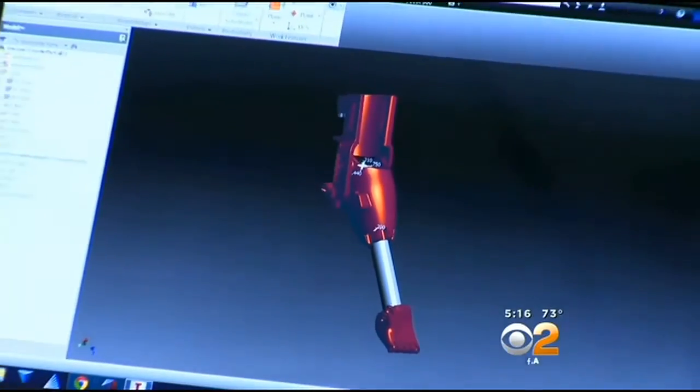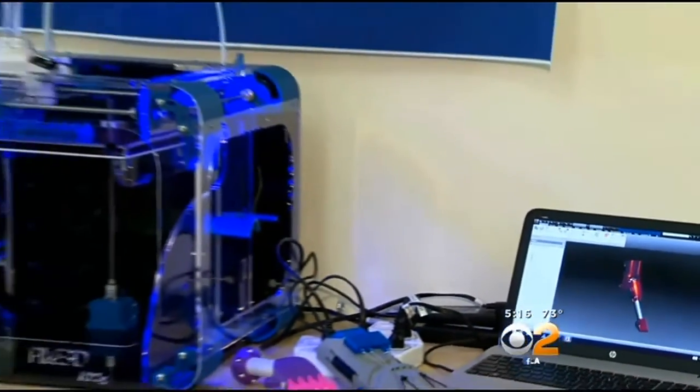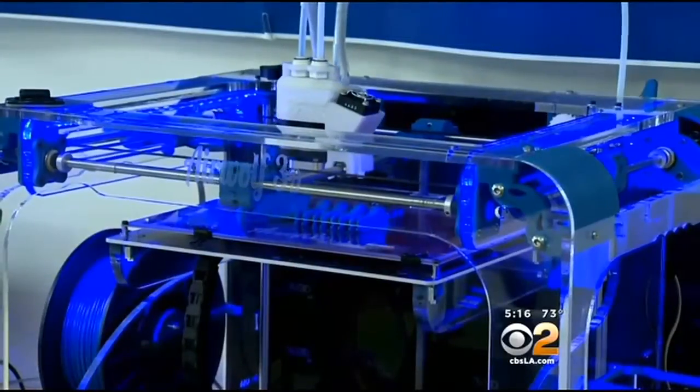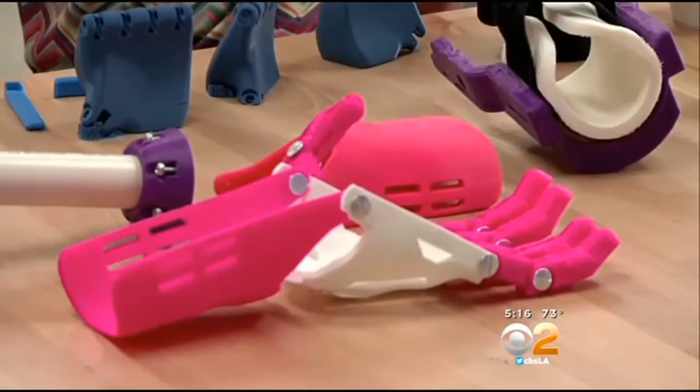Here's how it works: the computer talks to the 3D printer, which then builds the hand layer by layer. The whole process takes about 24 hours, and at the end of that you have a working hand. The cost to build a hand in the 3D printer — about $50 — compared to traditional prosthetics that cost thousands.